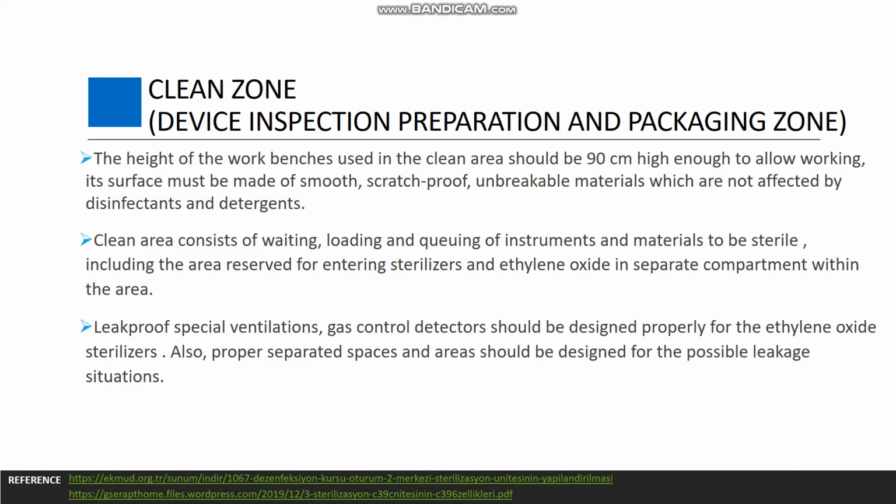Clean zone. The height of the workbenches used in the clean area should be 90 cm high, enough to allow comfortable working. Its surface must be made of smooth, scratch-proof, unbreakable materials which are not affected by disinfectants and detergents.